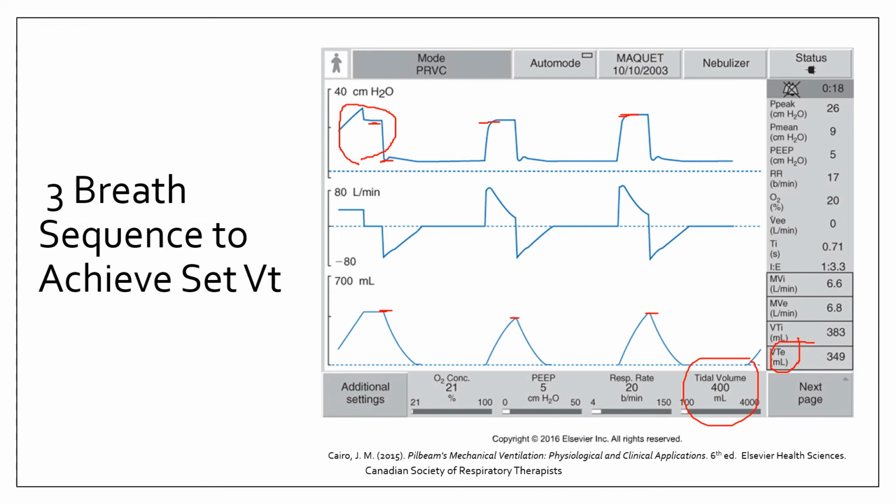So this mode is a really versatile mode. It's a good mode for the patients and for clinicians, because again, like I said, it's a bit more comfortable for the patients, and we're able to control our minute ventilation a little bit better, and we can be a little bit more precise when we're making any changes to the ventilator based on our blood gases to optimize our blood gases in the best way that we possibly can. So great mode to use in that sort of situation.